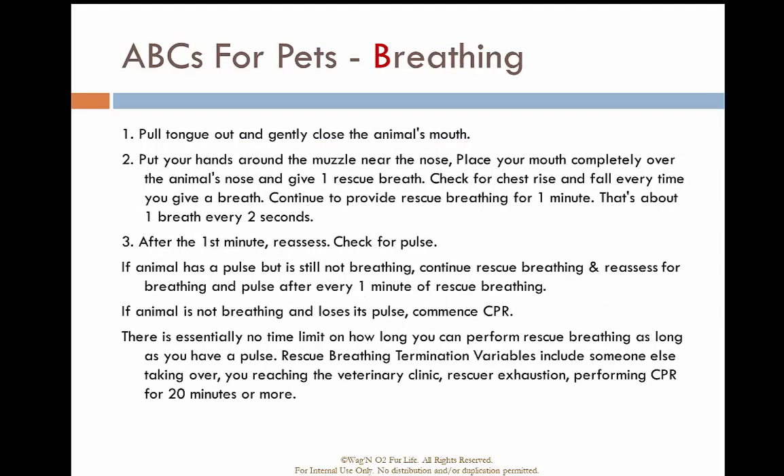Properly position the patient, put the mask over their snout, and provide ventilations — one breath every two seconds. After one minute, check for a pulse. There is essentially no time limit on how long you can do this, and it is very similar to what we do for humans.